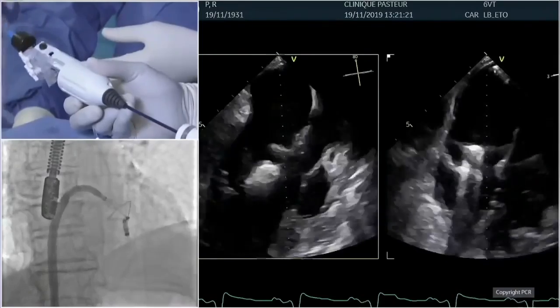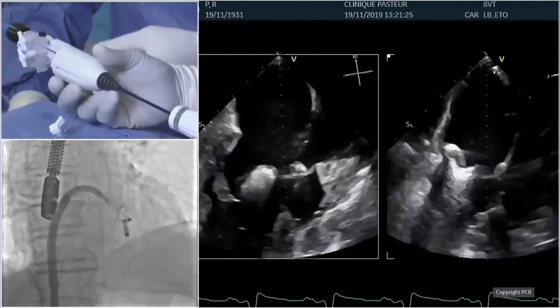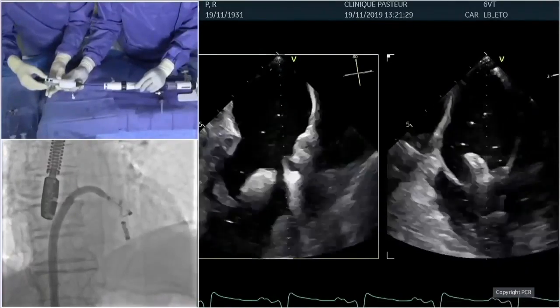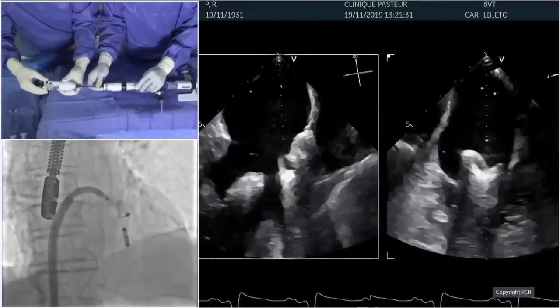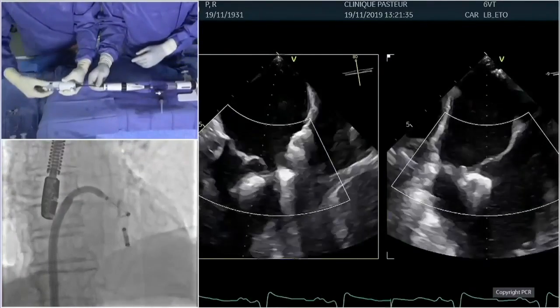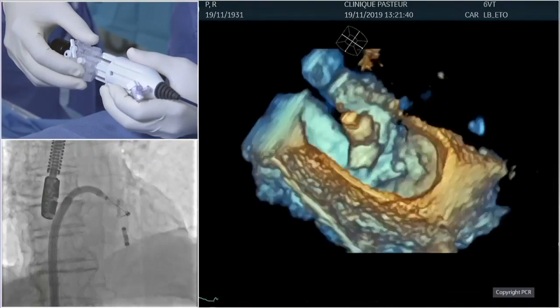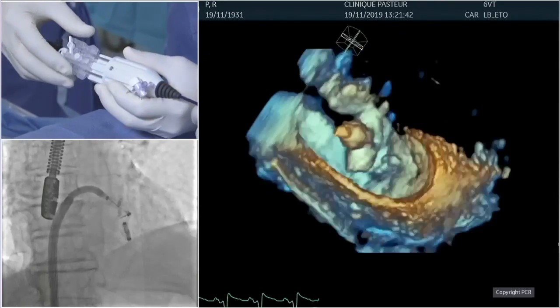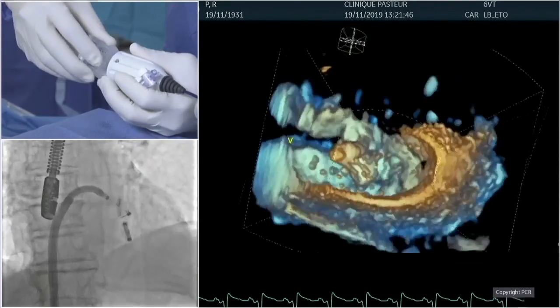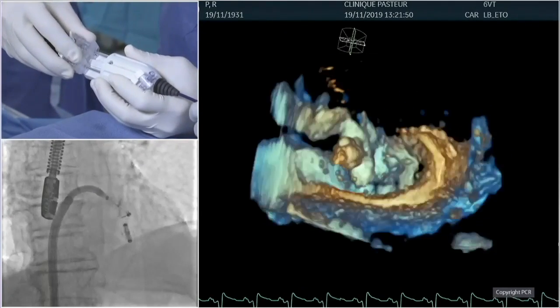We'll still use the 3D, for a couple reasons. One, we don't want to get too close to the first clasp, and you don't want to run the risk of hitting your first device. Sometimes the 3D will really help you direct your guide, and then also check trajectory. And then the other question is, if you elongate the device, you would have an even lower profile. Is that your strategy for the second crossing? It's exactly, if we want to cross, we have to elongate the device. It's not inverting, it's elongating.